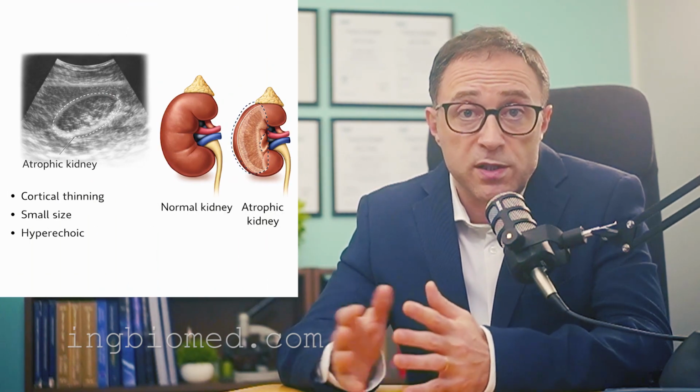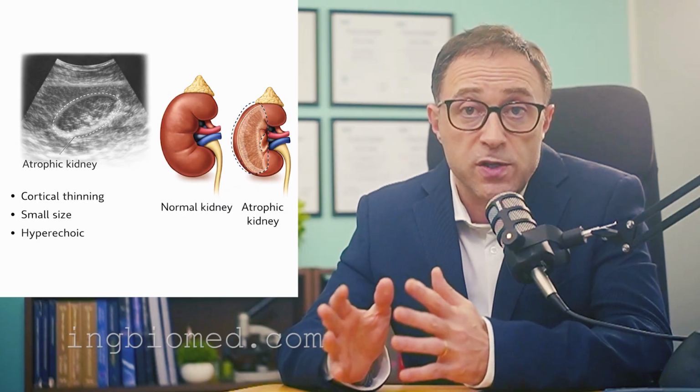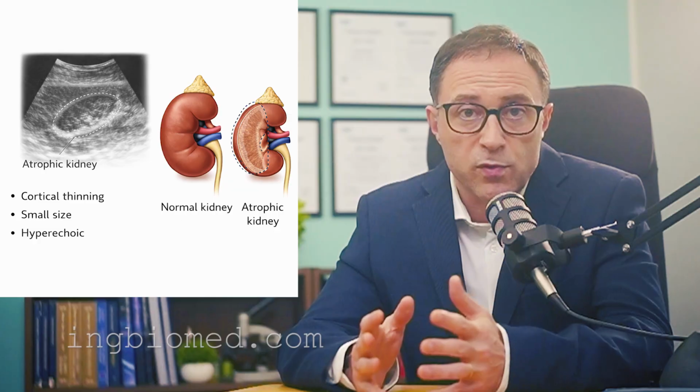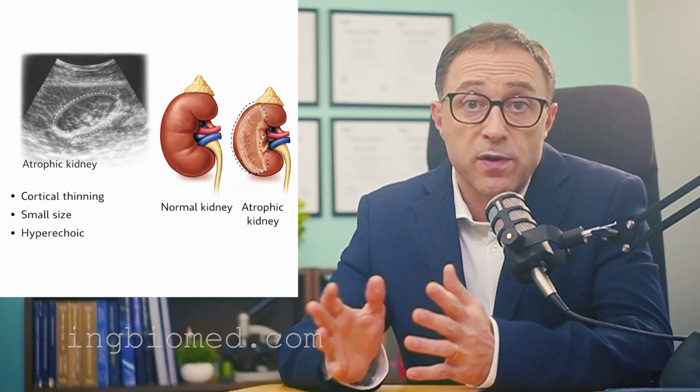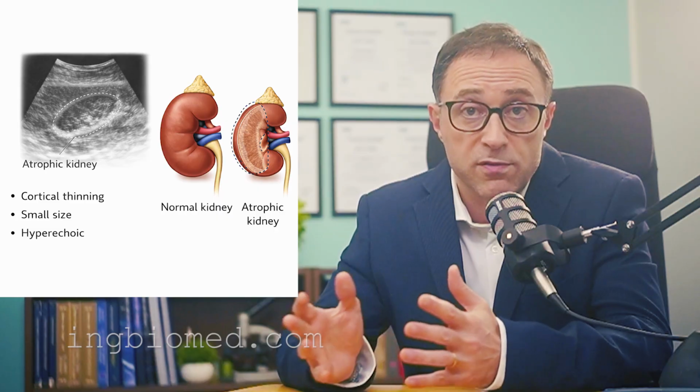Moving to degenerative changes, age-related cortical thinning is physiological to a degree. More pronounced atrophy may follow chronic inflammation, severe renal artery stenosis, or embolic infarction.